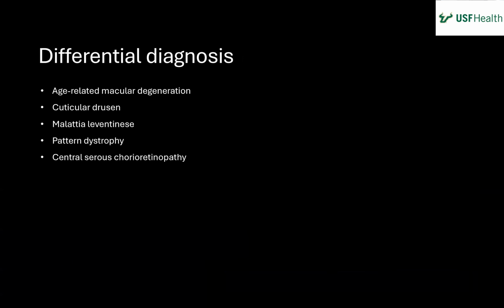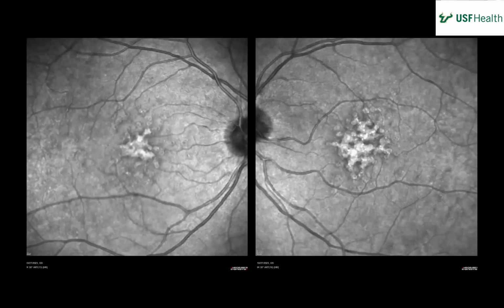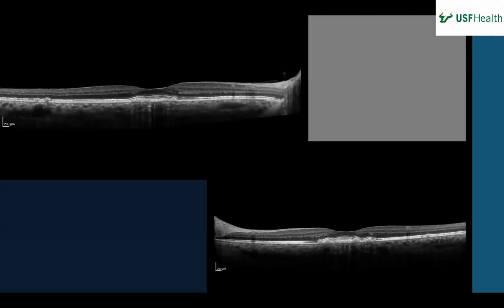So you'll get some people that are kind of bumpy, and I do have some of those, with a very thick choroid. And you can go back, I don't think this choroid's that thick, but a very thick choroid. Where are we? Yeah, that's not that bad, I guess. I can't really tell though. Definitely not the left. Well, it could be, but you're cut off, so you can't say it's not. So yeah, there's pachychoroid pigment epitheliopathy.